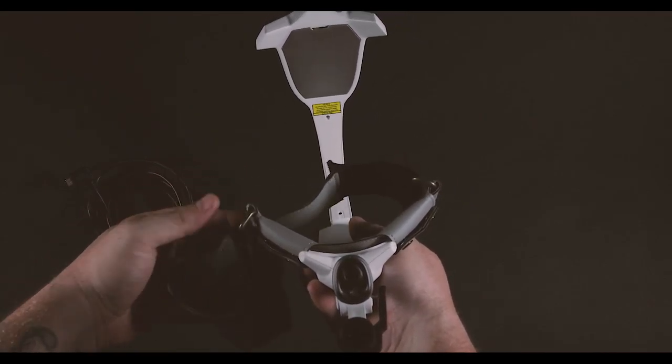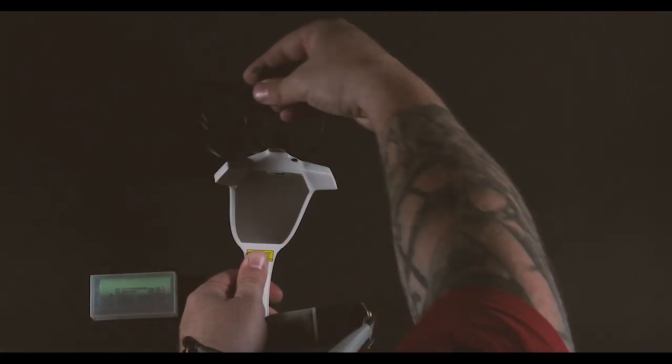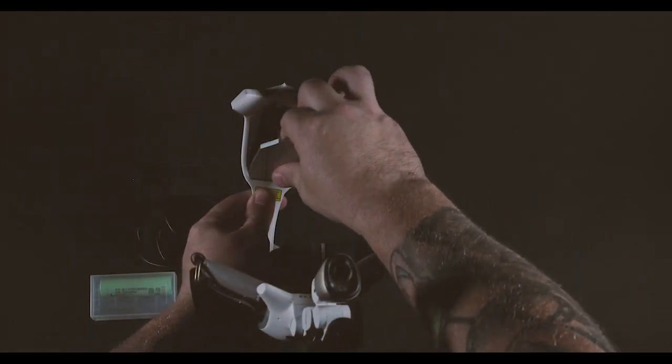So pull that piece off. You can use sometimes your nail, a quarter, something that's smooth — you don't wanna damage it. You can even take the cable that it comes with and just pop that. Just give you a little something to grab onto.